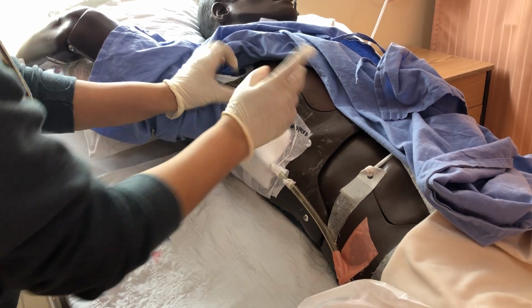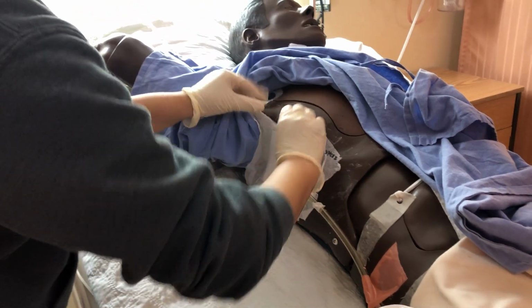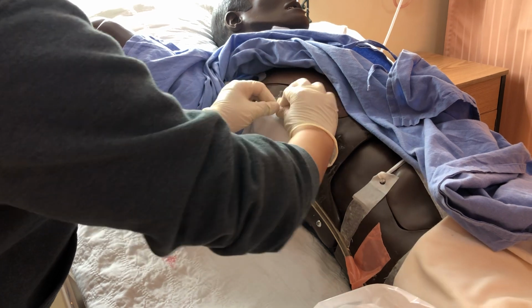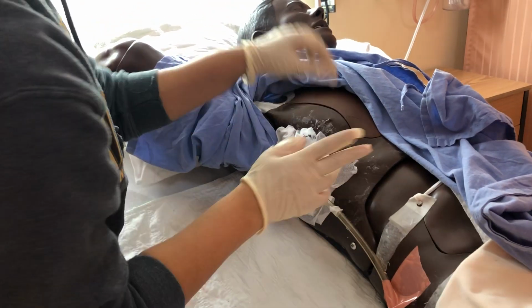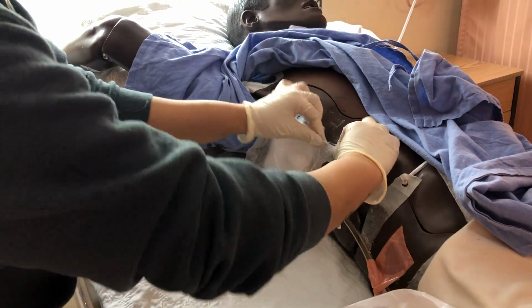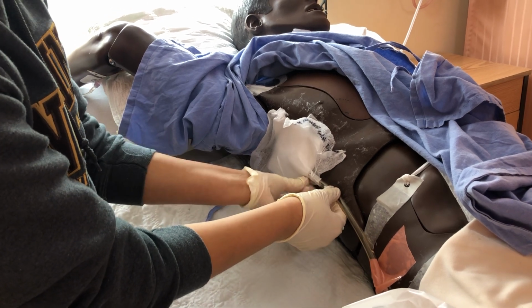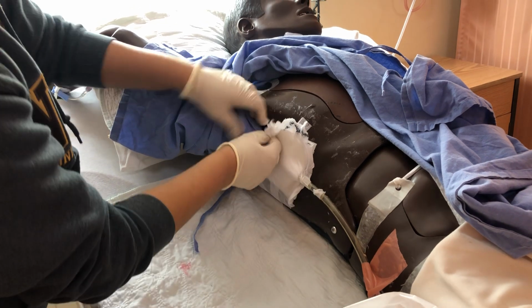So this would be a little easier if I use skin prep, but for the purpose of this video, I'm just gonna be pulling it a little bit harder. Right. And just to note, the chest tube wouldn't be moving a lot just because it would be sutured into the patient's site.